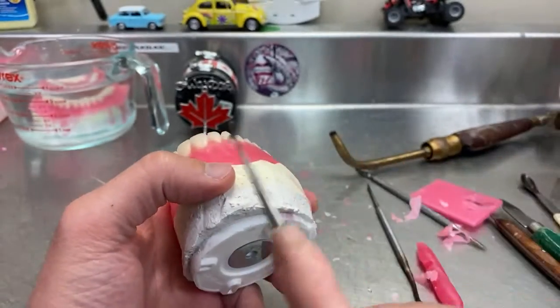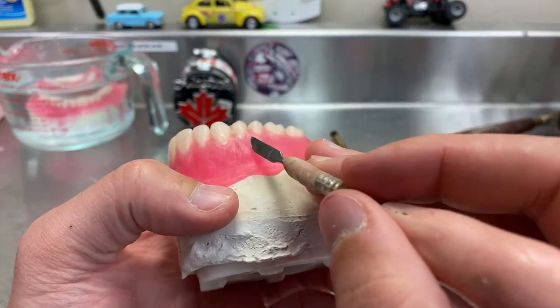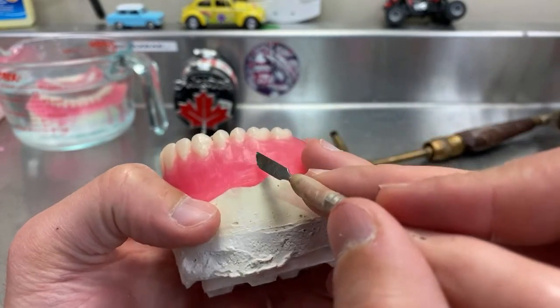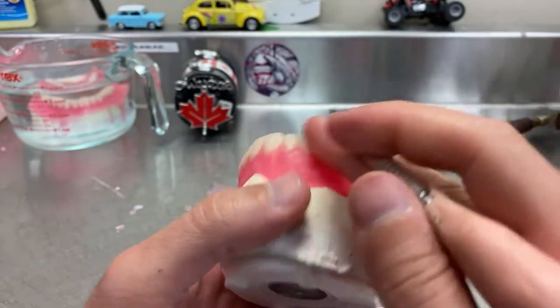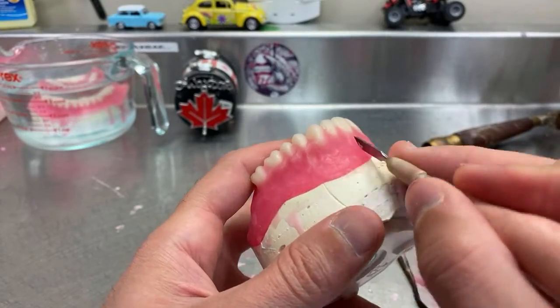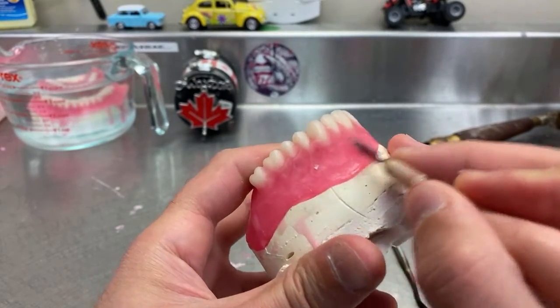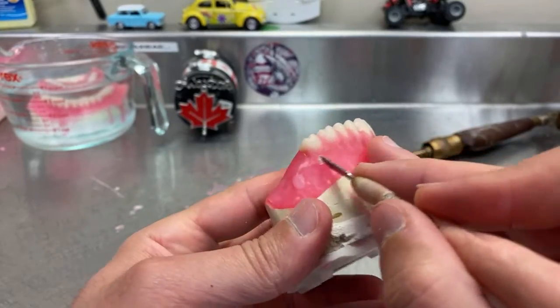So I'm going to be using this to actually modify it. And then the same for these, you don't even need to see the roots of those ones. So these, just give them a gingival roll and you're good to go. That's another thing that I notice a lot of people do. Good so far?